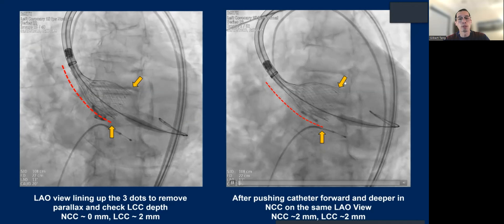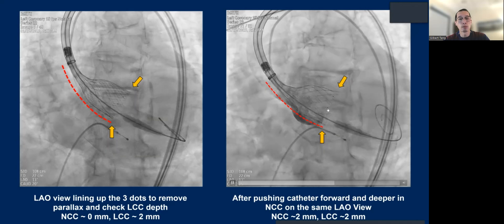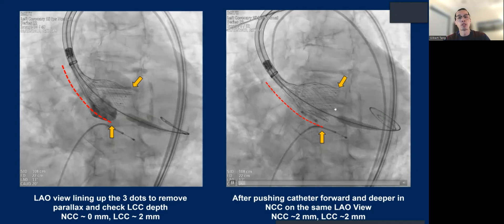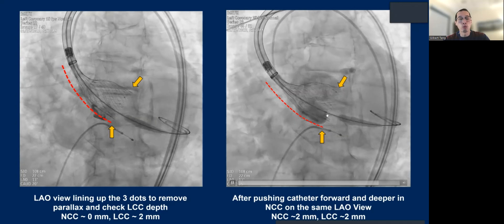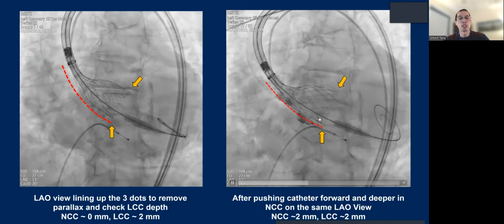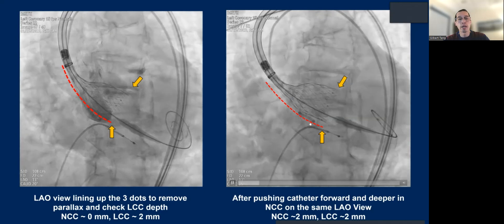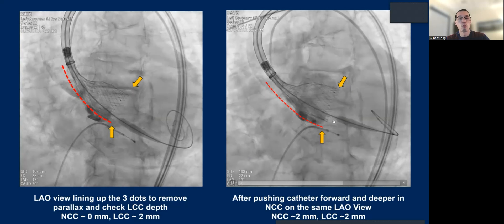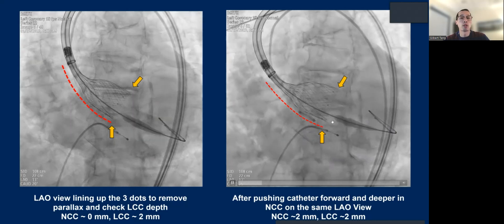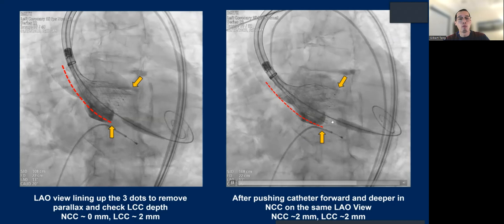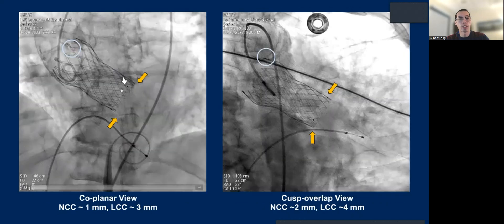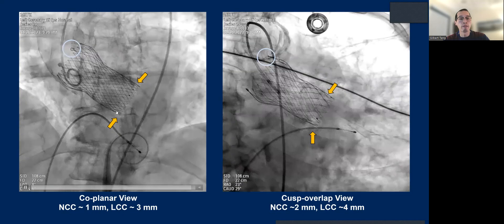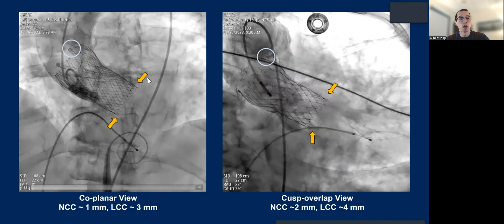This is an important observation. By lining up the three dots, you eliminate parallax, so you know you have a true inflow depth assessment. Applying forward tension on the delivery system — as shown by the dotted red line — clearly moved the valve to the more outer curve and gained 2 millimeters of depth. We feel we do not need to recapture and can release the valve without risk of pop-up. Sure enough, when released, the valve did not go more aortic — depth is 1 and 3 millimeters.